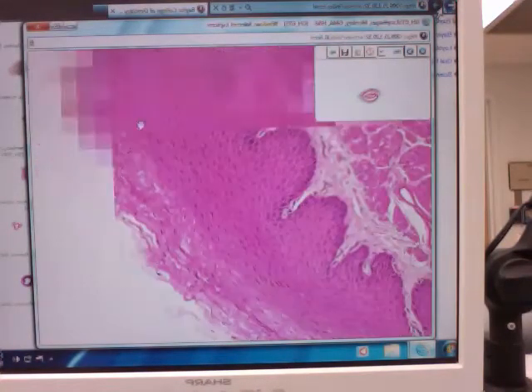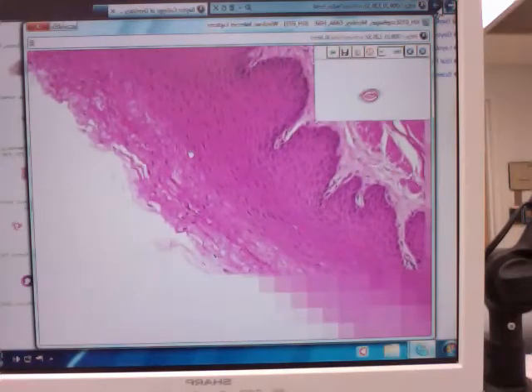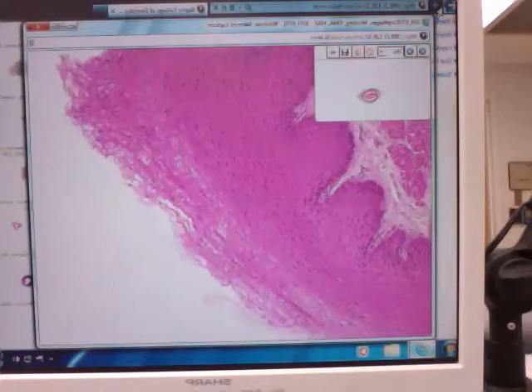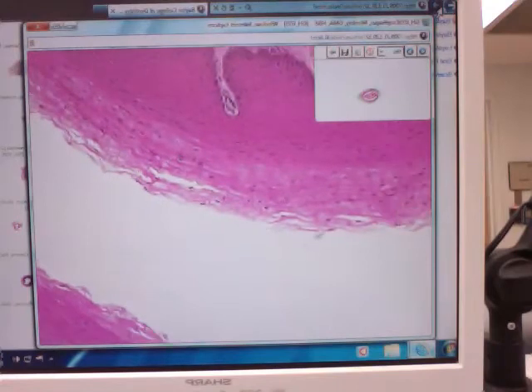So here's an example. Obviously, free surfaces and epithelium of some sort. It extends from here all the way out, so it's definitely a stratified tissue. Then what's the shape of the outermost layers of cells? When you look out here, you can see it's all flattened cells. Even though you see some of it ruffling off as you scan around, we would give you a spot where you can definitely see nuclei all the way out to the surface. It's not a dead layer of cells out here.